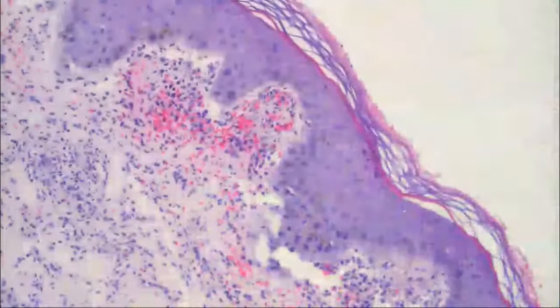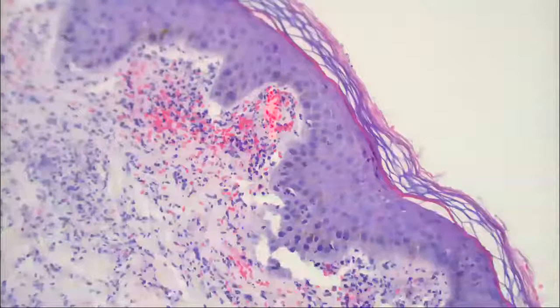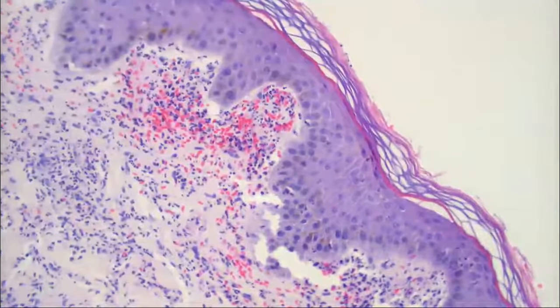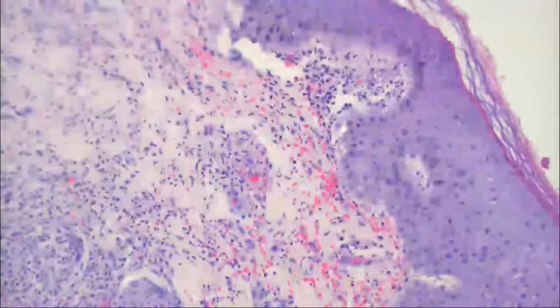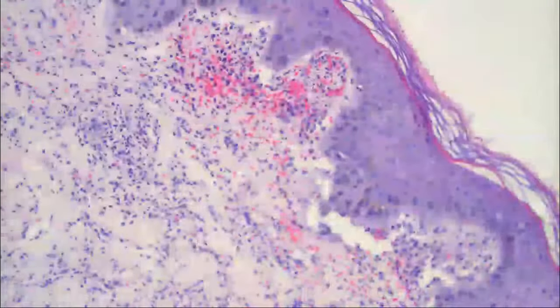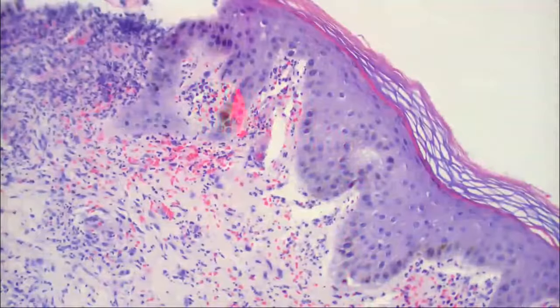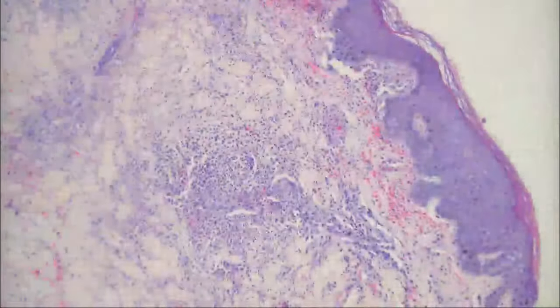They're very superficial, kind of almost interface, but they're in the dermal papillae, the tips of the dermal papillae. And it looks like there are little surrounding spongiotic type changes. Not quite vacuolar interface, but maybe a tiny bit of involvement. There's really not too much epidermal involvement yet. So what's the differential diagnosis when you see neutrophils within the dermal papillae like that? Dermatitis herpetiformis. Yeah, dermatitis herpetiformis. It's kind of an unusual pattern because it's got this deep inflammation also.